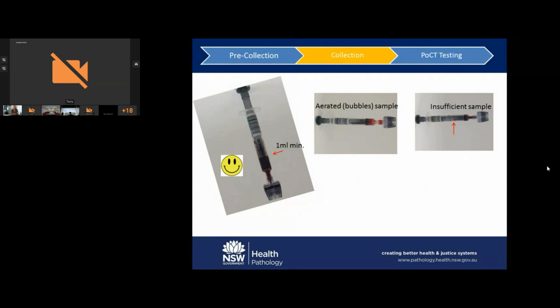Here is a collection well short of the required volume. This blood will be over-heparinized as the amount of heparin in the syringe is designed to anticoagulate optimal blood volumes. Too little blood is in fact a proven cause of high false positive troponins on both the ISTAT and lab analyzers. The syringes of some manufacturers contain what is known as balanced heparin that reacts as a set ratio to the blood actually in the syringe, but in practice, even this does not compensate sufficiently for very low volumes of blood, and effects on results are still observed.